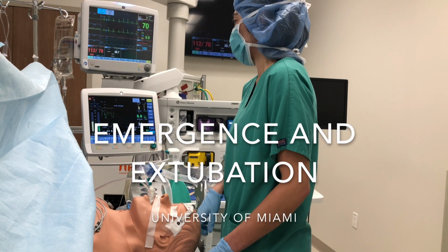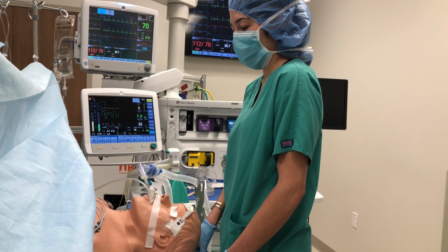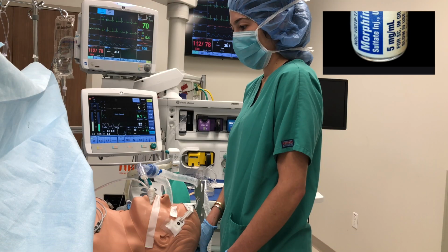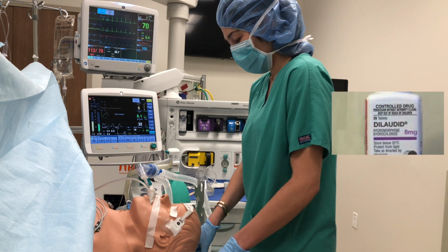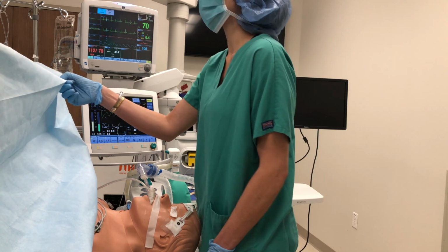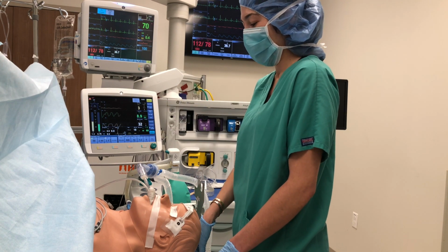In this video, we will review the emergence and extubation process. As the surgeon is finishing up the procedure, administer antiemetics and have a post-operative pain management plan in place. Verify the surgeon has completed the surgery. Fascia is closed and he or she is beginning to close skin.